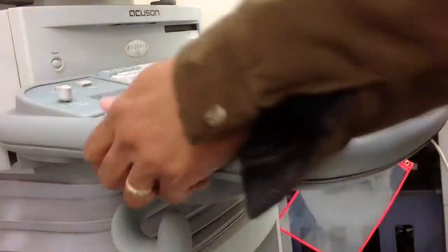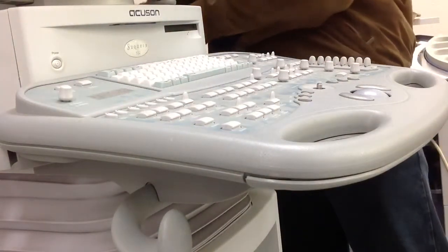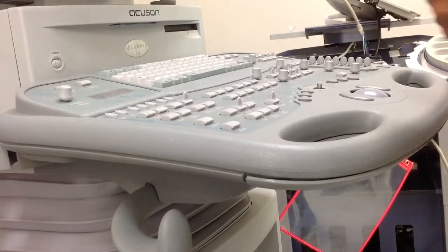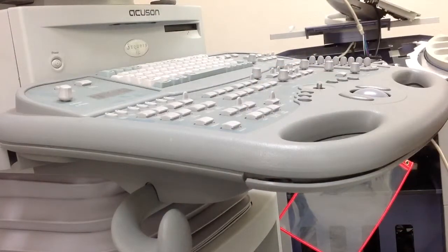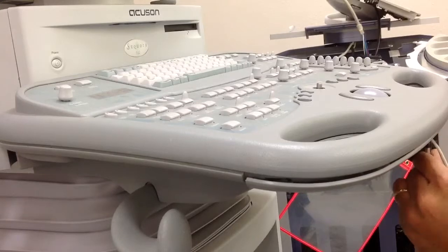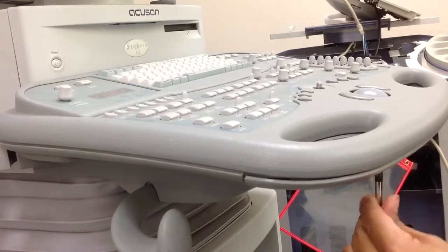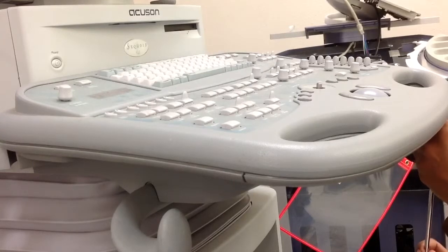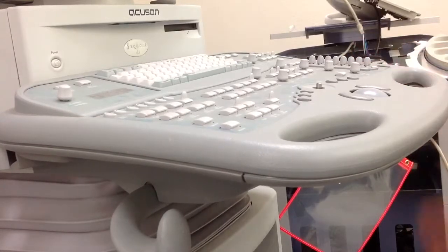And then the next thing to do is the screwdriver and the screws. Make sure when you're putting back the screw, don't tighten it up first. Just put it back like that, but don't put it too tight yet, just to make sure you have allowance to move the bezel.